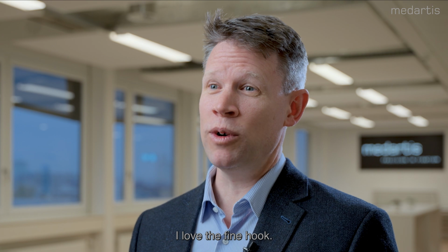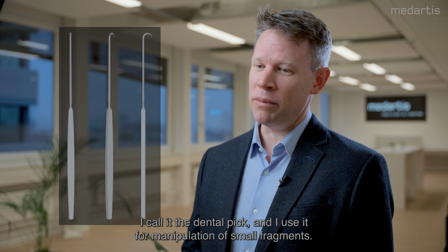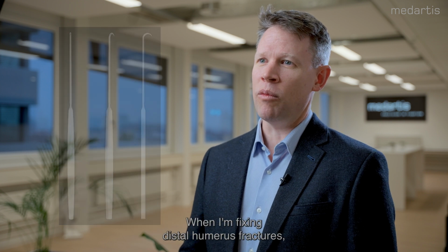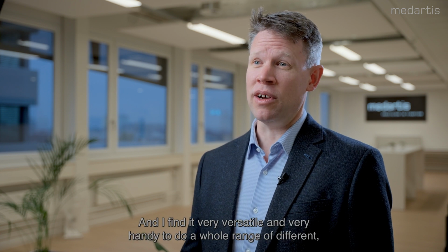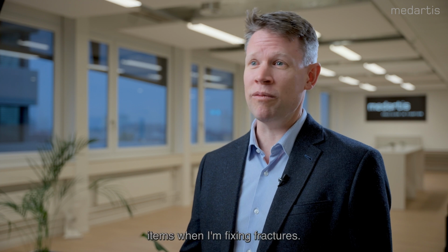I love the fine hook. I call it the dental pick, and I use it for manipulation of small fragments. I can compress the columns when I'm fixing distal humeral fractures. I can manipulate periarticular fracture fragments, and I find it very versatile and very handy to do a whole range of different items when I'm fixing fractures.